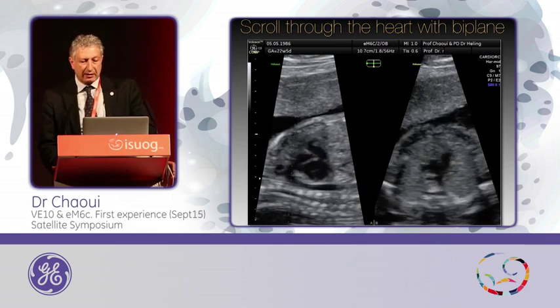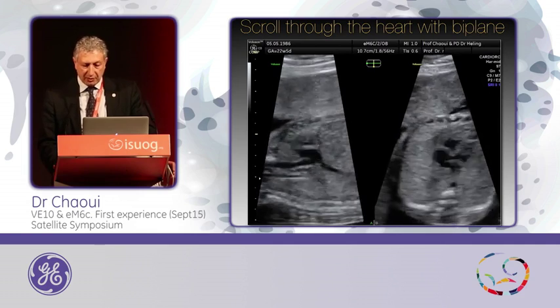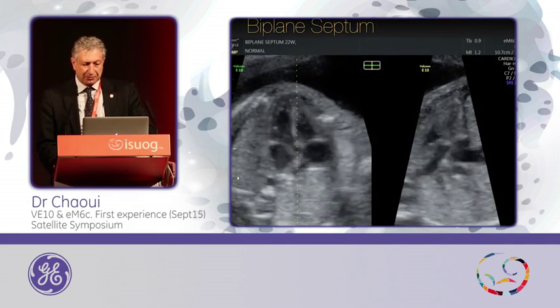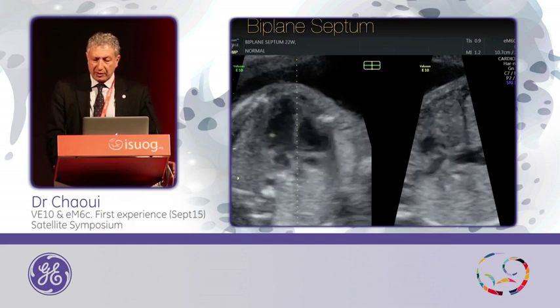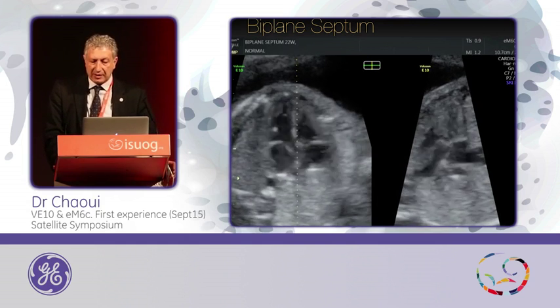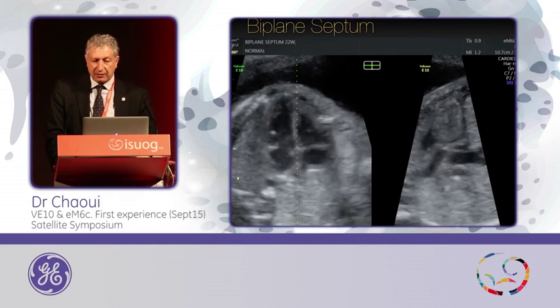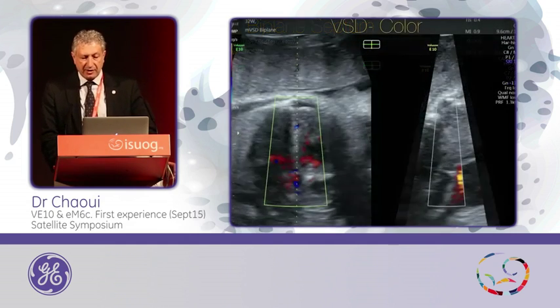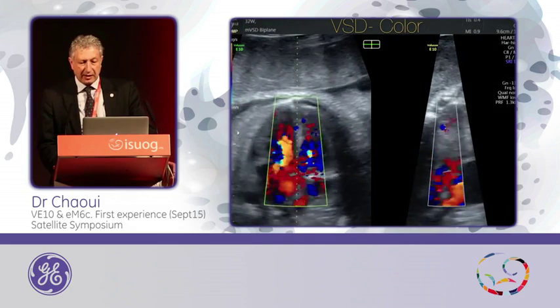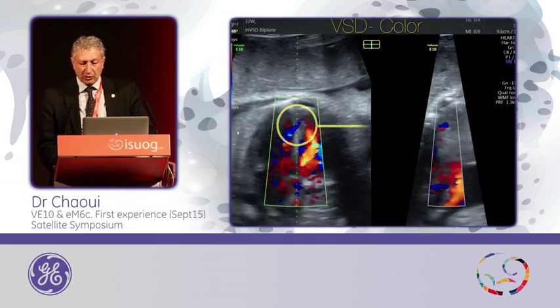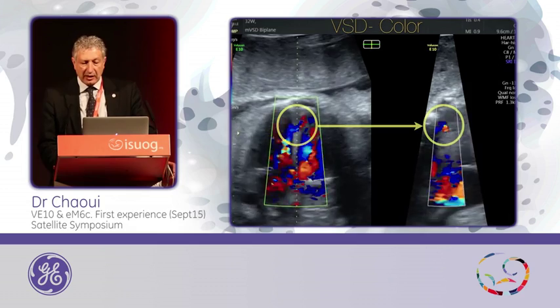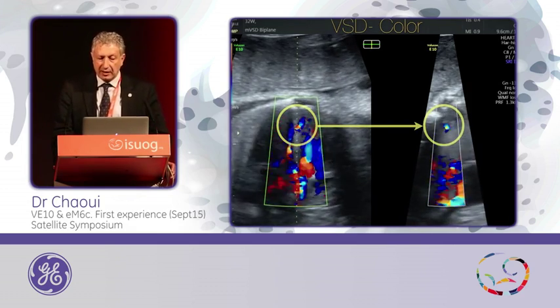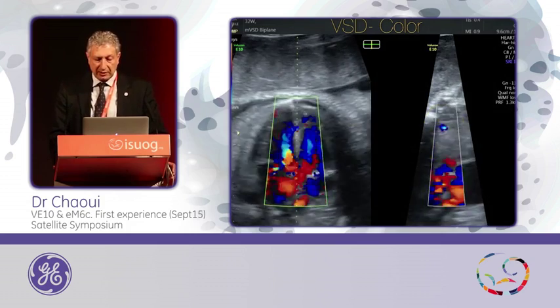So you can use the biplane for several purposes. I show you here another application — the septum — where you can see exactly the line along the septum. And it was obvious that the first case I had, where there was a ventricular septal defect in this plane, I was trying to show it in the other plane as well. And you see here that the VSD was seen in one and then the other plane, which was clearly shown.